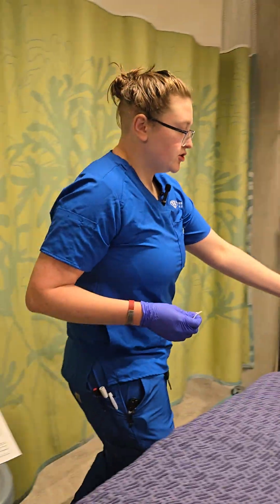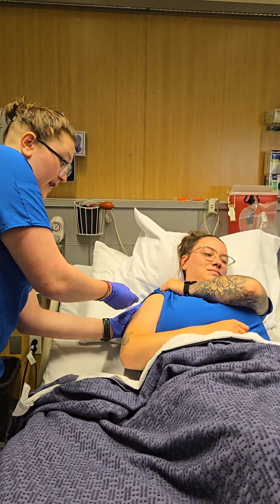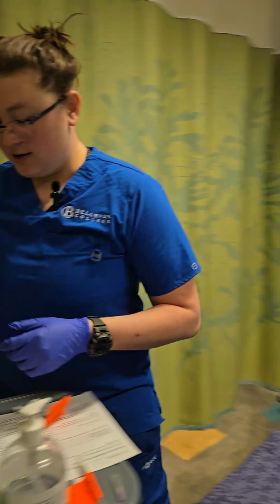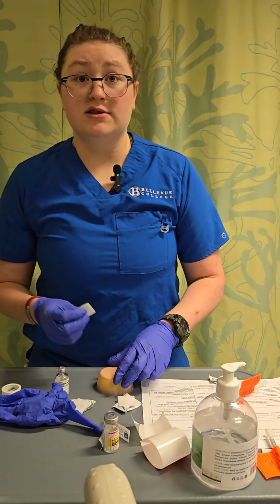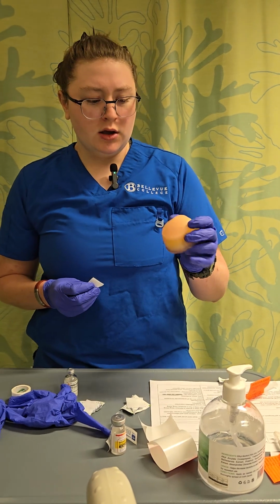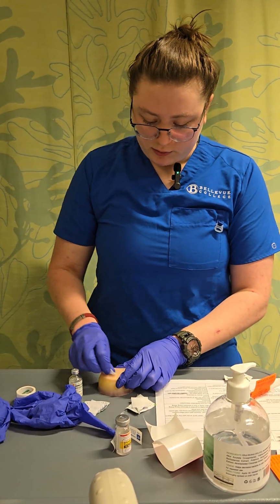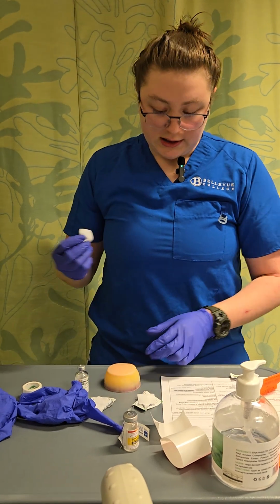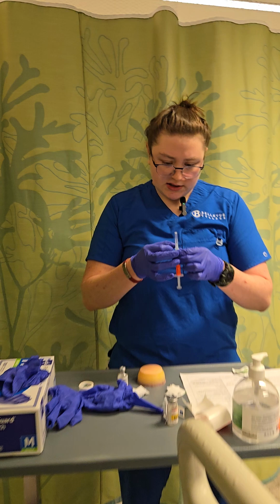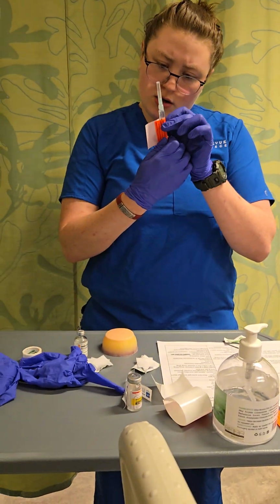Oh, we would also do a Z-track, which means that all I do is pull the skin over and then inject and then release. And that kind of seals it in and makes the medication access the muscle and not the subcutaneous fat and not a subcut route. Okay. We're going to use this guy again. We're going to rub. We're going to let it dry. I've already ascertained all the correct rights. Cool. Made sure that this is the right amount, and it's right there.